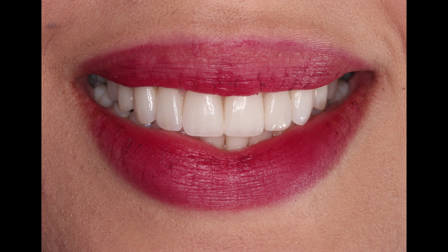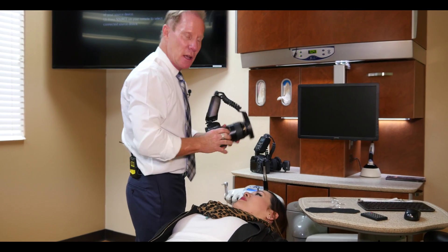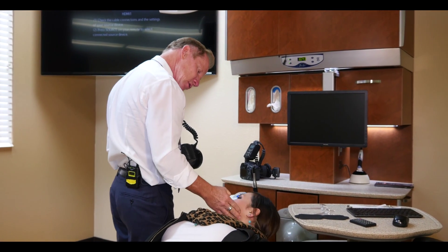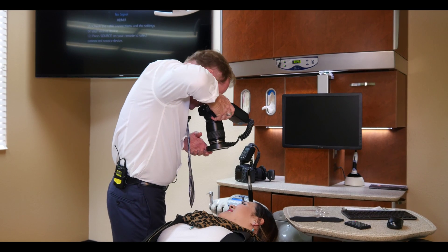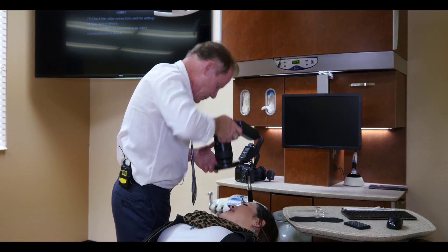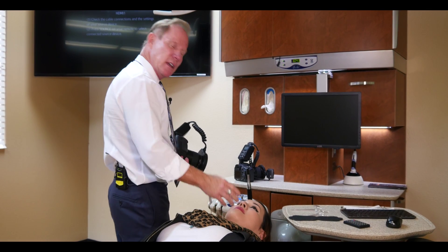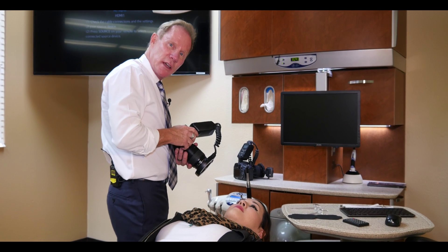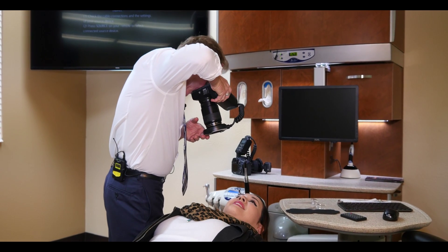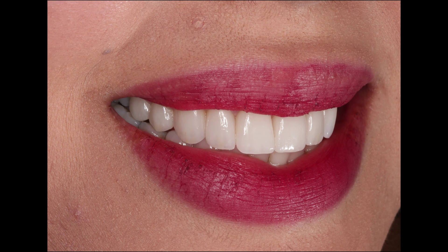Now we're going to take a left-side full smile. Instead of climbing to the other side, I keep it at one-to-two. Turn to your right — big smile. Now turn to your left — we'll take the left side. I want to be comfortable so I can be stable. Big smile.